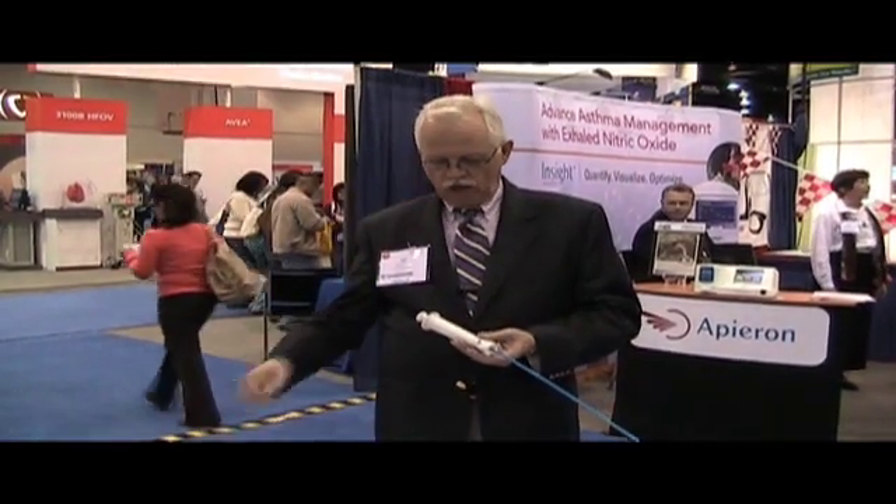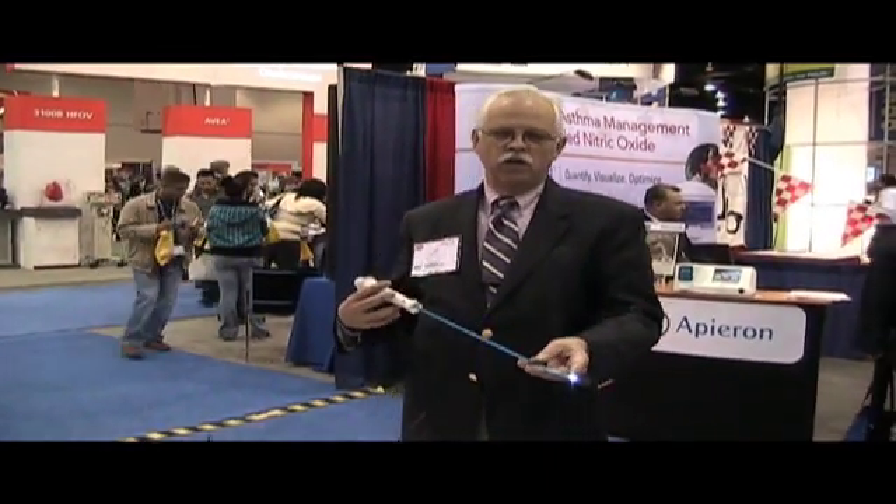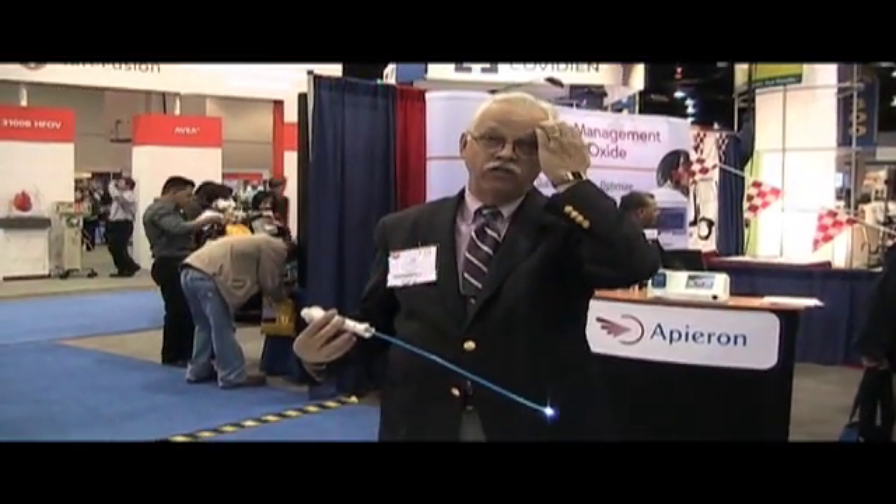Everything from this plug all the way through to the end of the device where the light is, is disposable. There are no batteries in the handle itself. All the power for the unit comes from the monitor. In the end of this, we have a video camera, a little cell phone camera, and a couple of LEDs that give us our light source.